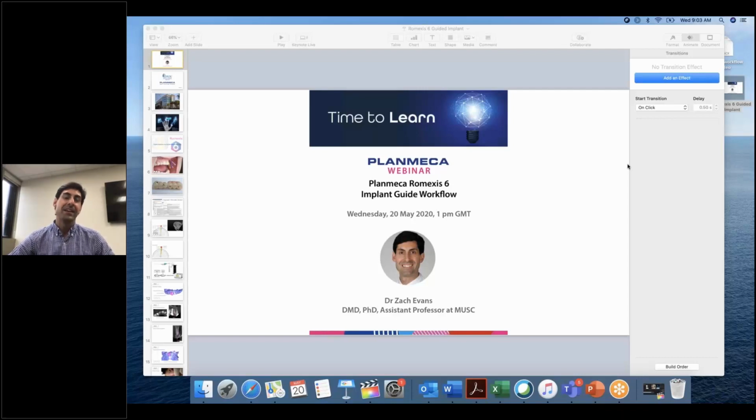It's my pleasure to be sharing some of our experience using Romexis 6 for implant guide workflow. We've been using it for a while. We were really fortunate here at MUSC. We have a really nice partnership with Planmeca, and we do a lot of beta testing and some consultation for product development with them.